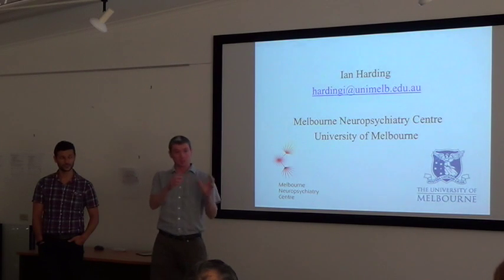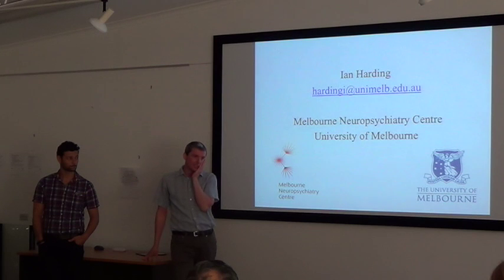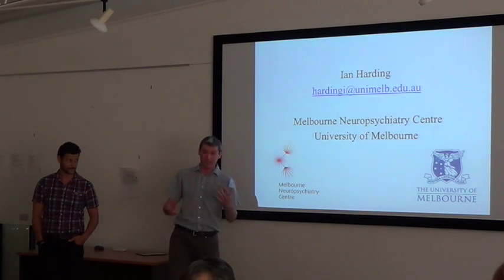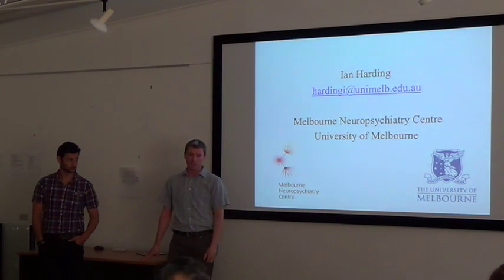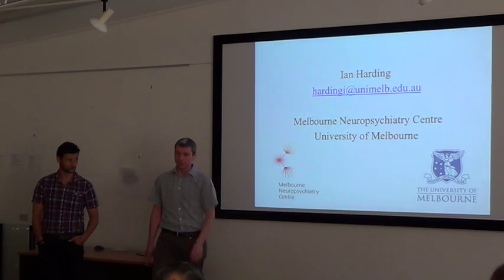So I was talking about blocks, sort of switching for 20, 30 seconds, but you need to scan generally on the order of 10 minutes in order to get a reasonable signal to noise. So 10 minutes is kind of the minimum. You can split that up. You can do 5 and 5, or if you have really antsy participants, you can even do 3 minutes, 3 minutes, 3 minutes, and do a bunch of those. I'm working on a kid study at the moment. We have 3-minute blocks, but we do 5 of them, 5 times 3, in order to get that power.